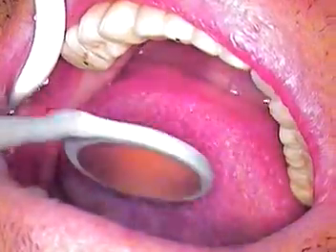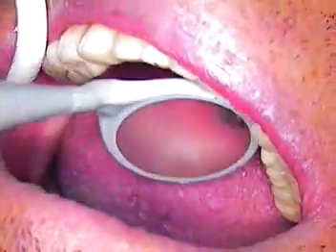Oh, there it goes. Okay, we're going to check your mouth. Make sure there's nothing rough in there. You okay? Anything on your screen? Okay. I'm just going to look because it's a pretty small item. Just going to do a quick look here. You're okay underneath?